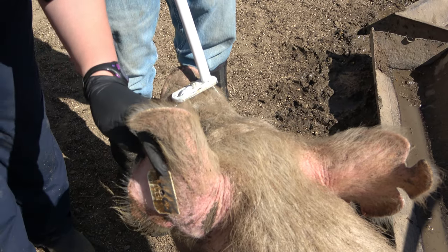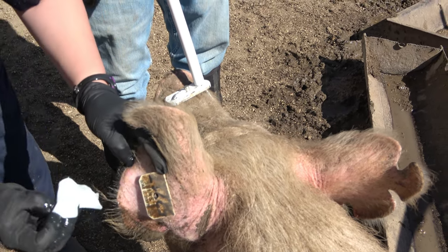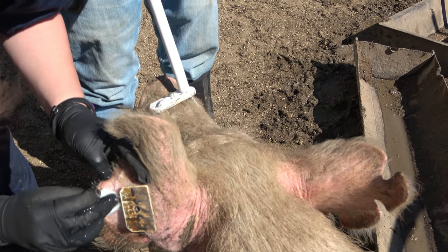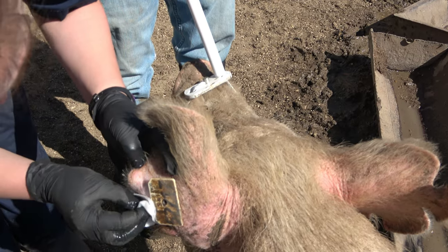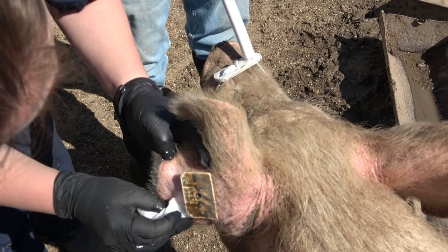Oh, and I just touched that. So we do want to make sure that we don't touch the space that we're going to insert our catheter in. So I'll just give it one more scrub and one more alcohol here. There we go.